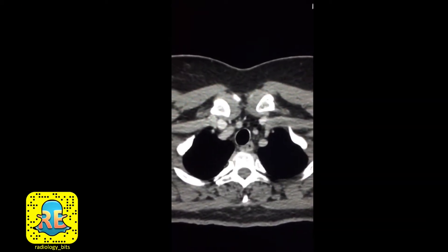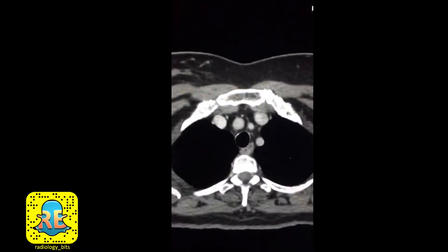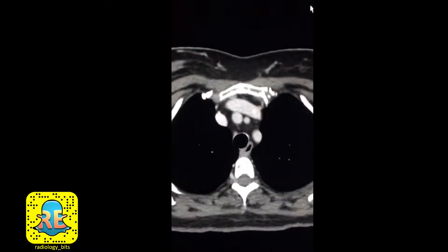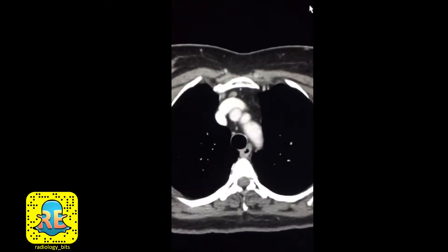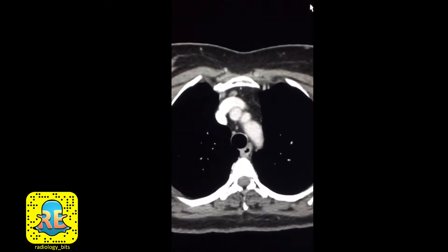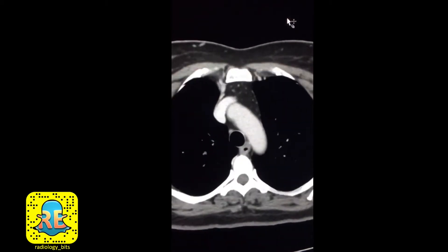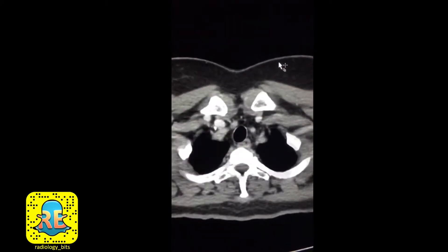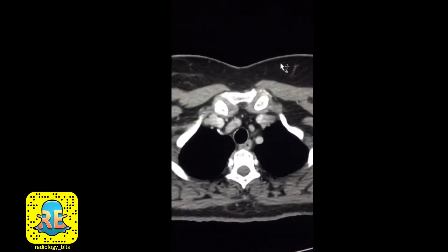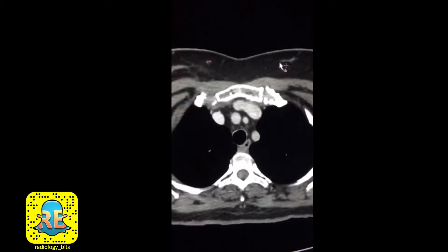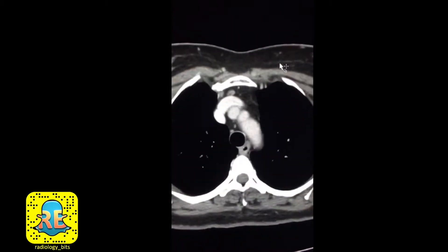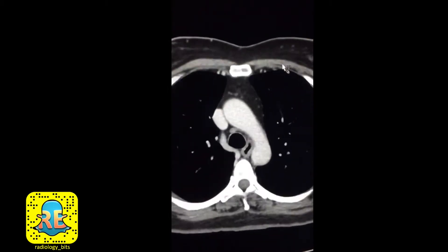Hi again. This is a show-and-tell case that's more dedicated for seniors, but juniors stick around — you're going to learn one or two things hopefully. I'll give you a chance to have another look at this chest CT performed with intravenous contrast on a 49-year-old female patient.